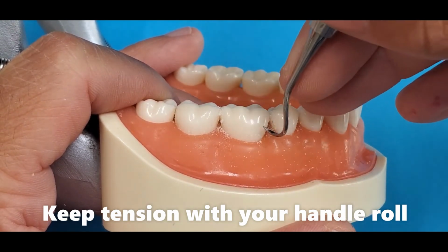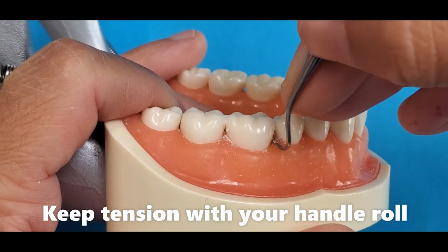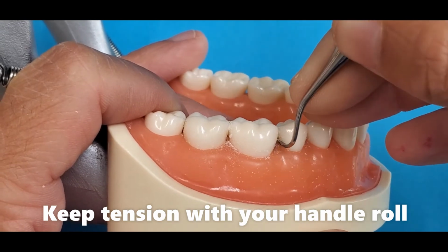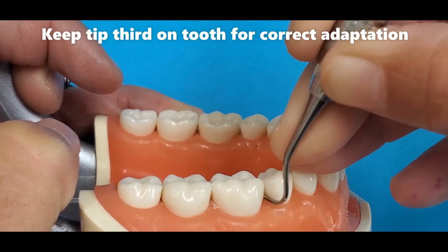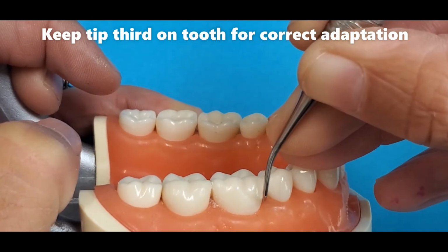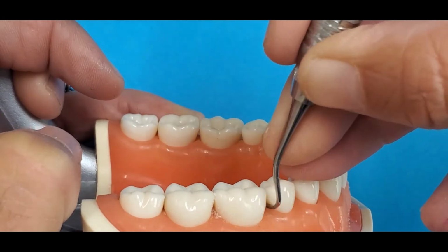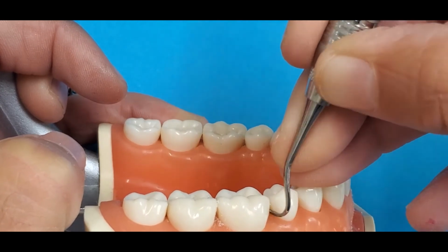So we accomplish that by really making sure you have a good handle roll, and then you can still use wrist motion activation and be successful in that stroke. Look how far the back is from the tooth surface. So not this way, but a big turn. Make sure you work halfway across the mesial surface.